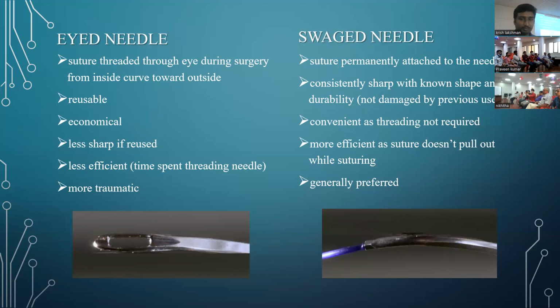Yes, can you just go back one slide, one point? The third point which says economical, the eyed needle. It's not because it's cheap; it becomes economical because you're using the eyed needle 3 or 4 times as against using 4 or 5 swaged needles with the material. That is why it's economical.